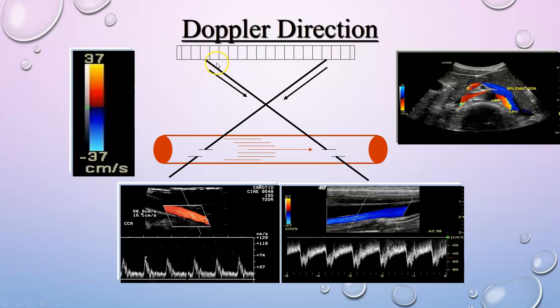And when we talk about the position of the transducer, we're actually talking about where on the transducer the insonation line for the Doppler is. So even though you may have a wide transducer here, we're only using the left side here when we're insonating in this section on the right side of the vessel. So this is coming towards this transducer if it's flowing this way. In this case, the arrow shows the blood flowing away. So this would be away from this point of the transducer and toward this point of the transducer.